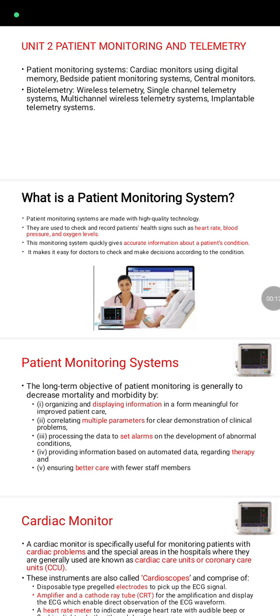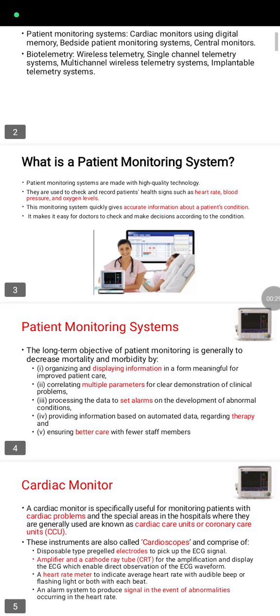They are used to check and record patients' health signs such as heart rate, blood pressure, and oxygen levels. This monitoring system quickly gives accurate information about a patient's condition. It makes it easy for doctors to check and make decisions according to the conditions.